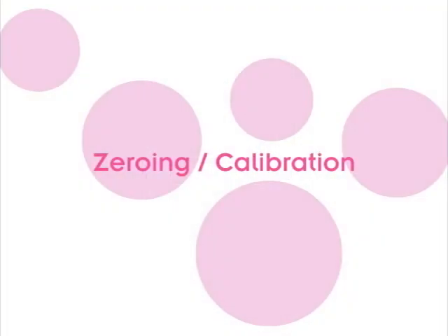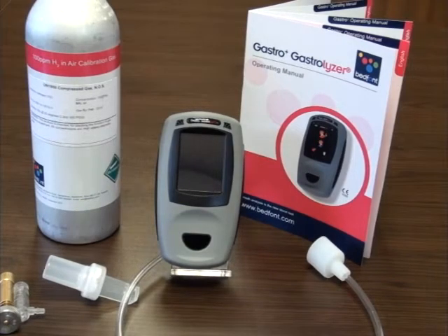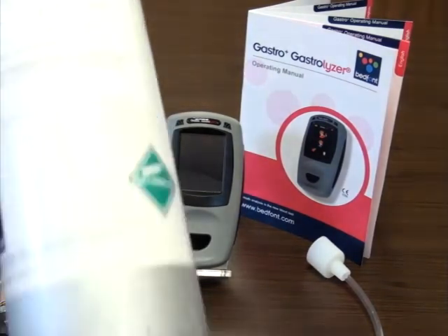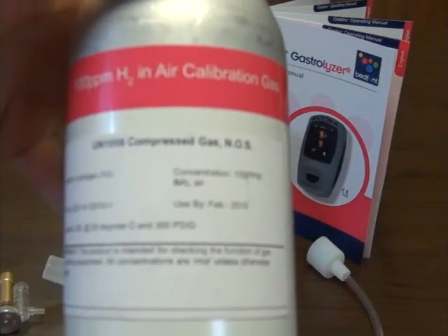Zeroing and calibration. To calibrate and zero your Gastroplast Gastrolyzer, please follow these simple steps. You will need the following equipment supplied to you from Bedfont or your local distributor. It is important you use Bedfont calibration gas and equipment only, to prevent any damage to the instrument or any false readings. In this kit you will find a 100 ppm hydrogen balanced in air gas canister.